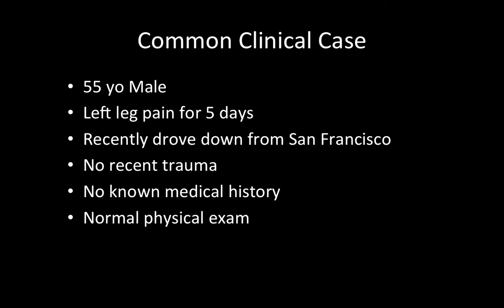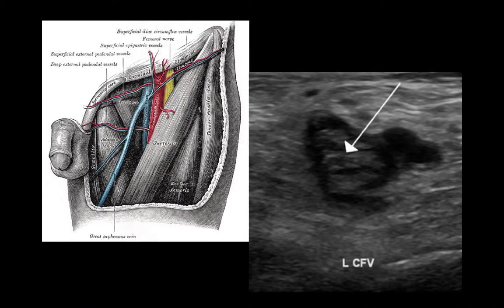His physical exam is pretty benign. He has some tenderness to palpation in that lower leg, but no significant swelling. His neurovascular exam is intact, and his lungs are clear. So where do you go from here? So we're going to focus on bedside ultrasound. You can quickly evaluate his symptomatic leg and diagnose a DVT.